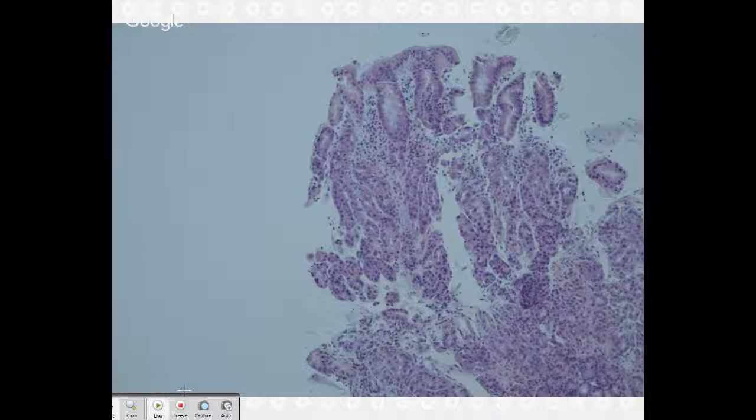So then under the scope, you not only see the ring mitotic figures, but also eventually those cells will just give up and die. And so you see all the apoptotic debris. So you see both. You see the increase in mitoses or mitotic figures, some of which will be ring forms, and you see all the increased apoptotic debris. And like you said, it also looks very reactive. The cells are big, but the nuclei, the chromatin's open.